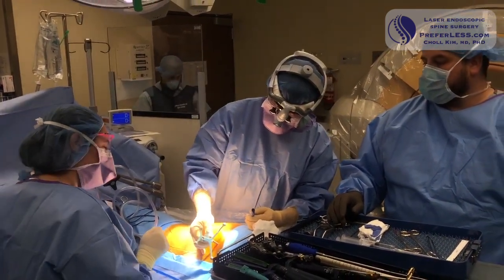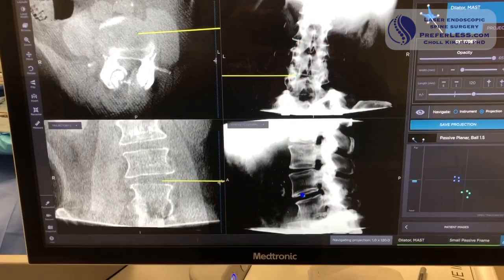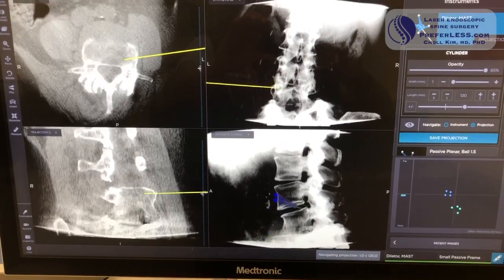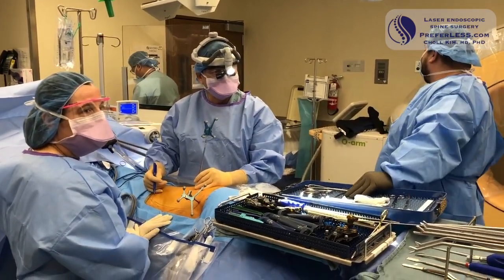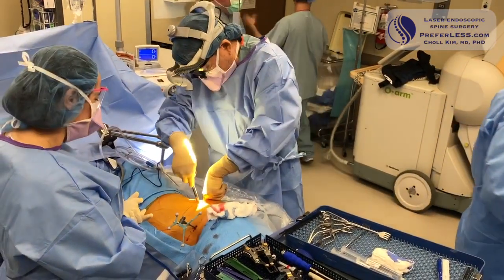What just happened there? Make sure the balls, check the balls. You know what I think about wrong level surgery, don't you? There's no excuse for wrong level surgery. I'm just sorry. That's why I'm kind of freaking out right now, making sure we got the right level. Oh, sorry. Very deep.